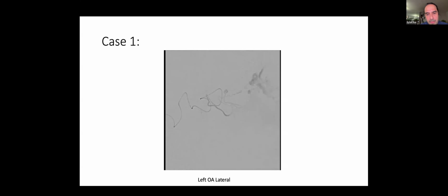But what I like here, let's look at these images. Where is the contrast going eventually? Is that all rupture and extravasation, or is it indeed finding some outflow through some maybe very tiny venous outflow? I agree with you on the other comment. It's hard to say. I don't think that's extravasation just because of the chronology of the case.